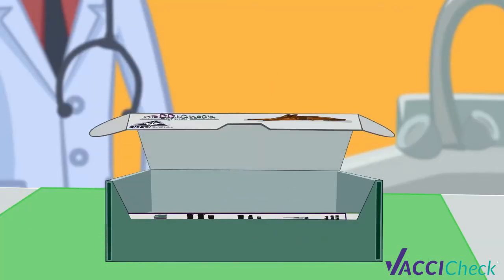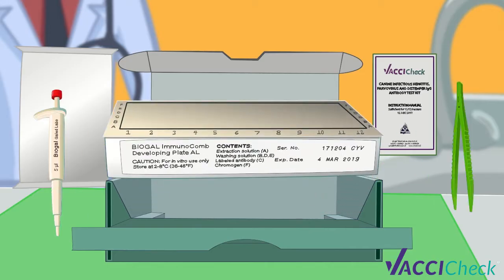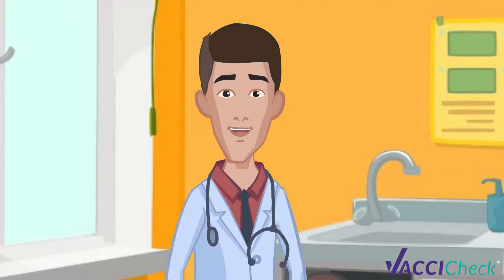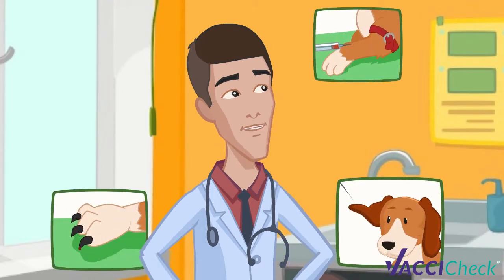Before conducting the test, bring the developing plate to room temperature by removing all kit components from the kit carton for at least one hour. Obtain a blood sample from the dog in a way that's most comfortable for you.